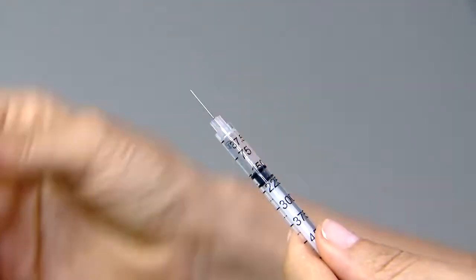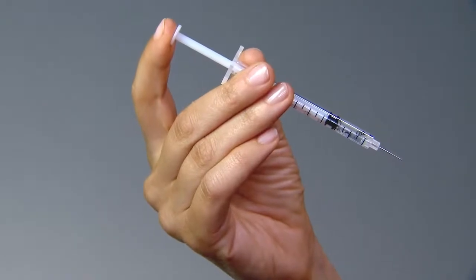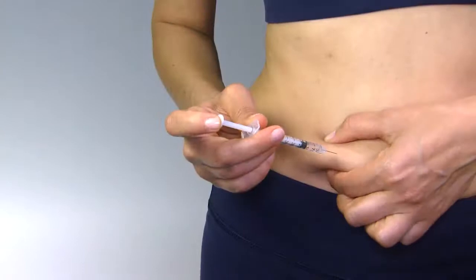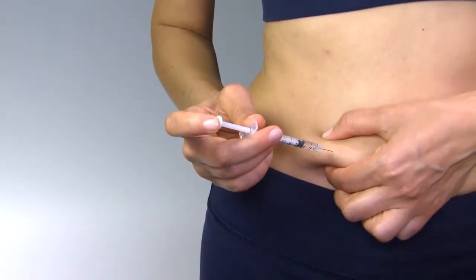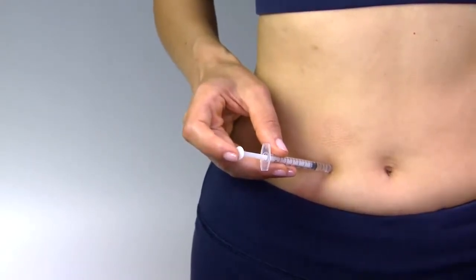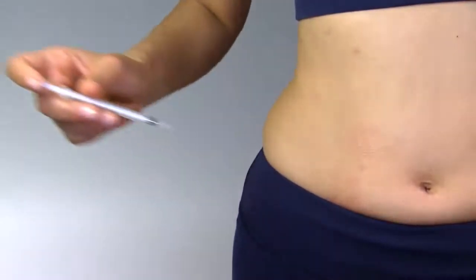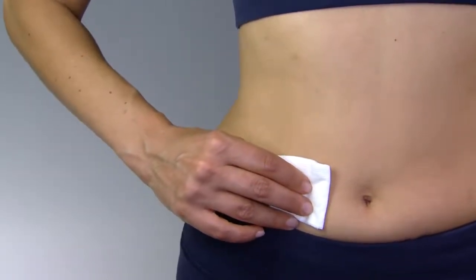Uncap the injection syringe. Hold the syringe with one hand the way you would hold a pencil. With the other hand, pinch the skin around the injection site. Insert the entire length of the needle completely into the skin at a 90-degree angle. Once the needle is inserted, you may release the pinched skin and depress the plunger in a slow, steady motion until all the medication is injected. Gently withdraw the needle and apply pressure to the injection site with a sterile gauze pad.